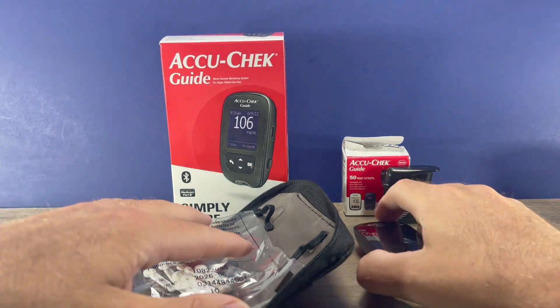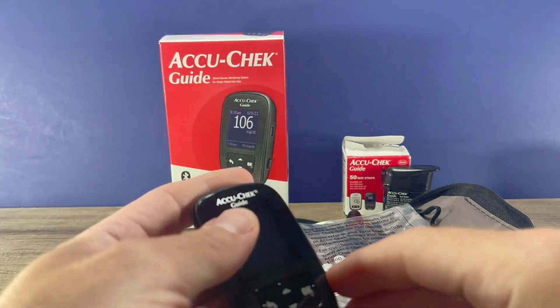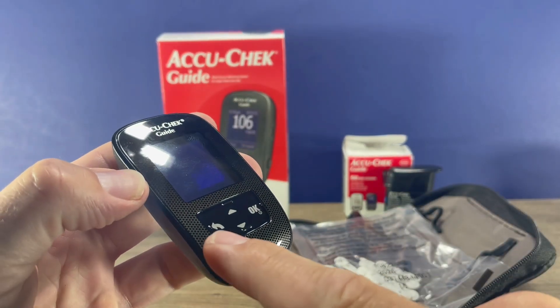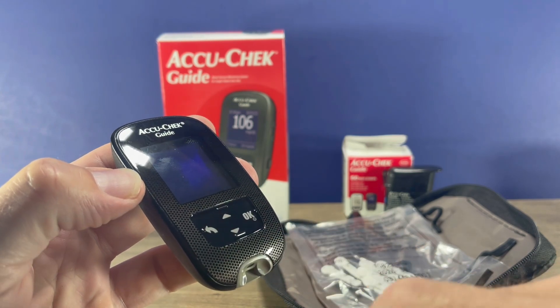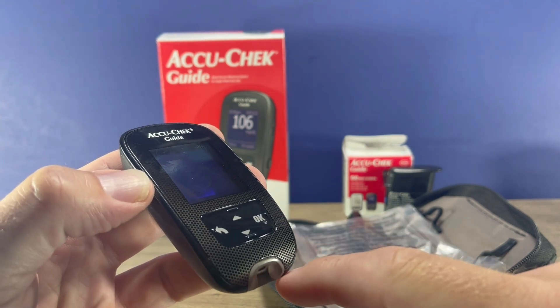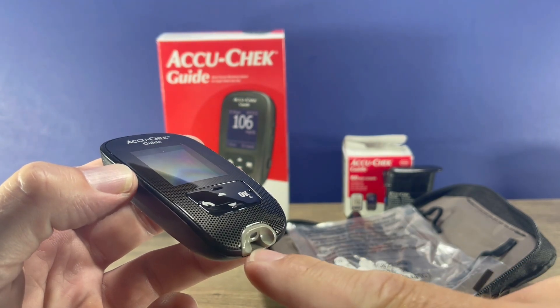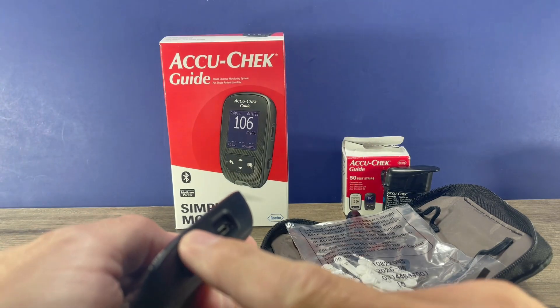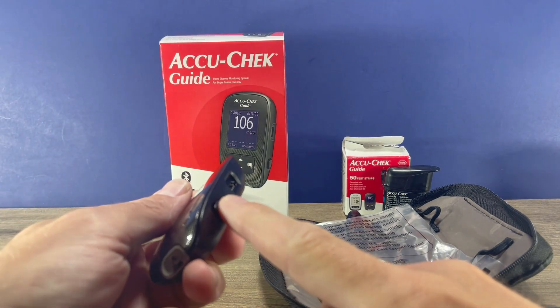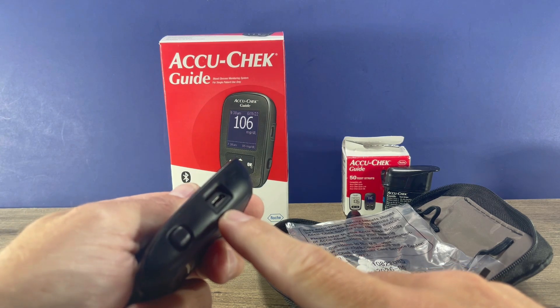So first of all, let's get our meter set up. We can look at it and see there are buttons on the front: this is the back button, and there are up and down buttons to scroll through the menus, the OK button which also powers on the meter, and test strips go right in there. On the side you'll see the test strip eject button, and then a USB port — that's not for power, that is for downloading to a computer.